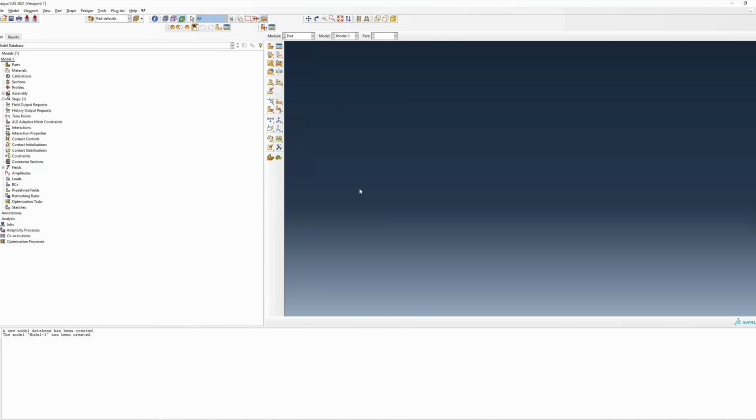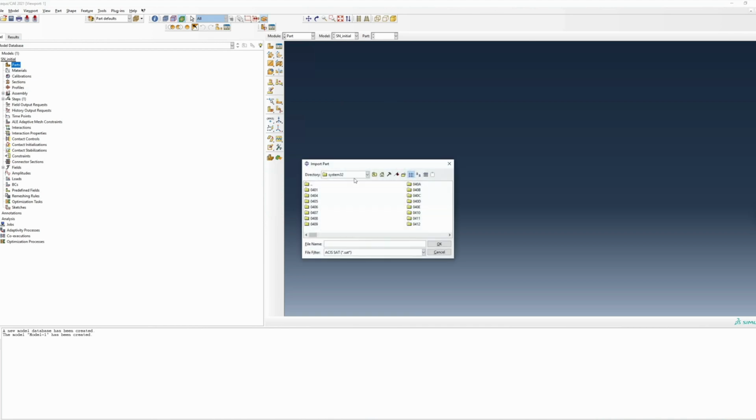For most of you, I'm sure that the most interesting portion of this video will be the step-by-step instruction guide on how to apply the basic settings required for biomechanical analysis in Abaqus. As we get started here, you'll be able to see me create an initial analysis file. This will be predominantly used for creation of an Orphan mesh, as well as implant positioning and the resection of the full bone models.